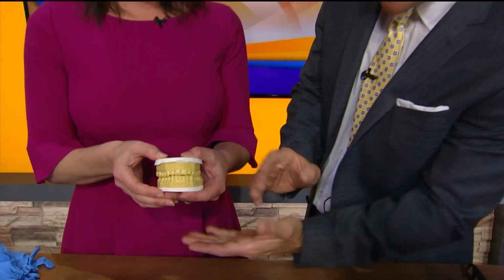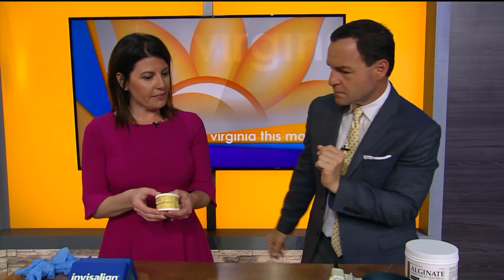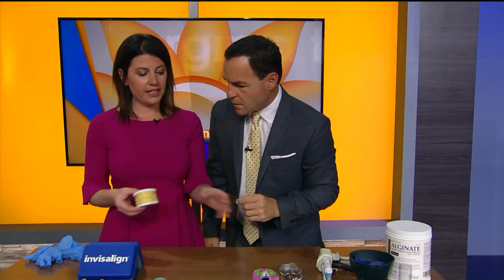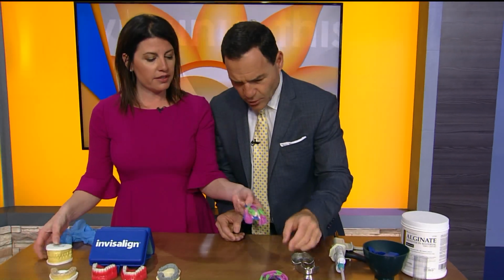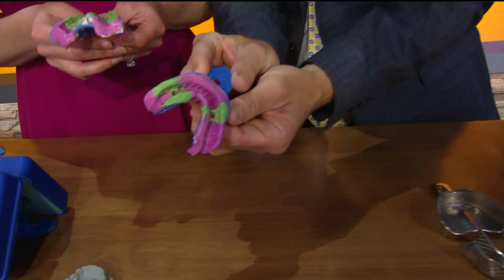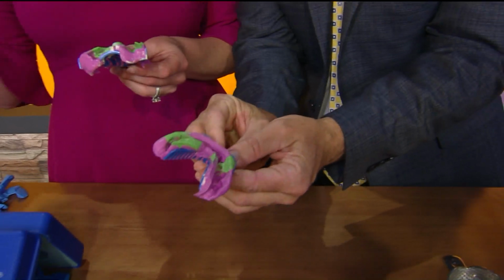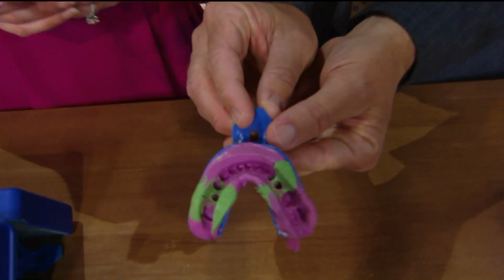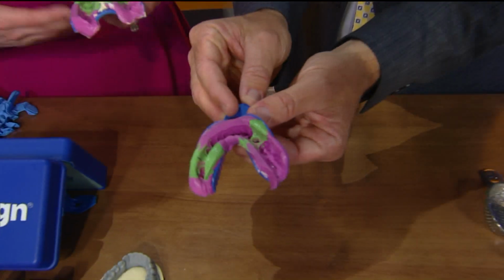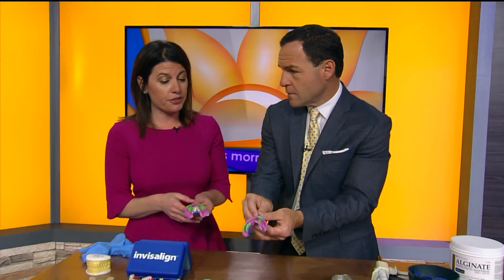And they are pretty accurate to how he looks. This is amazing. When you have this technology, when these show up, how exact is this? It's as precise as we can get. With the old school impressions, look at this, they had to sit in the mouth for about 4.5 to 5 minutes. And if anything is off by a bubble or some discrepancy with the material or saliva, or the patient gags, we have to take it out, we have to take it over.